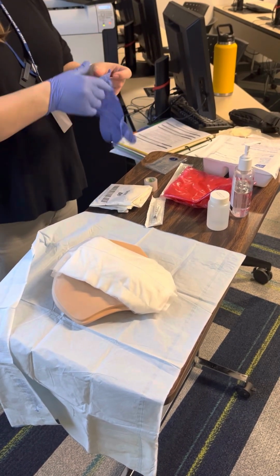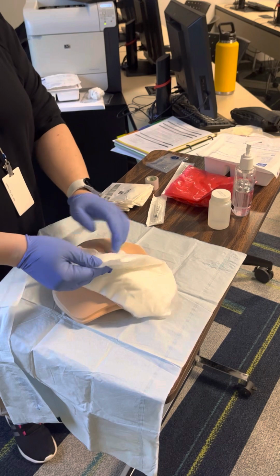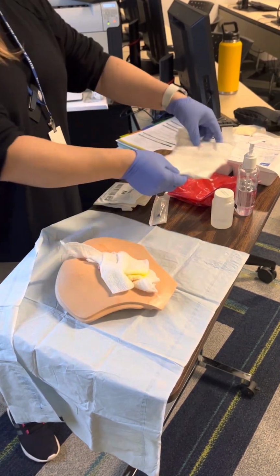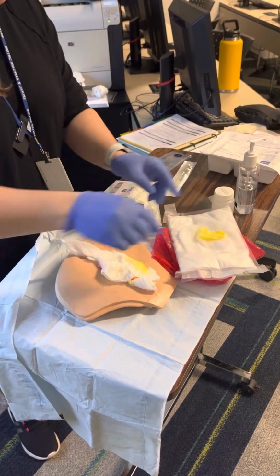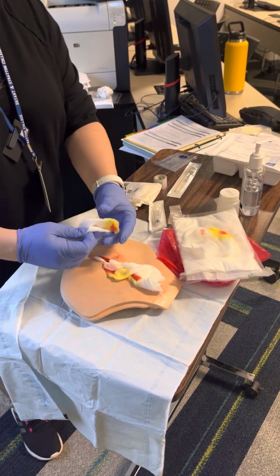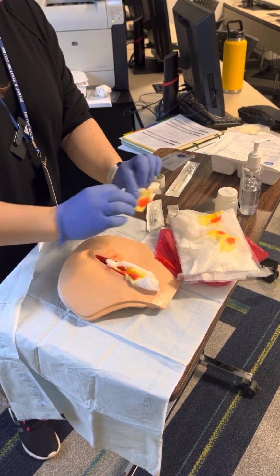I'm going to remove the tape of the surrounding dressing, and I'm going to look at the gauze one layer at a time. So I'm taking off the pad first. I don't see anything. I'm placing it in the garbage bag. I'm taking the next one. I see some yellowish drainage. I'm gonna keep going. Just looking at each layer.